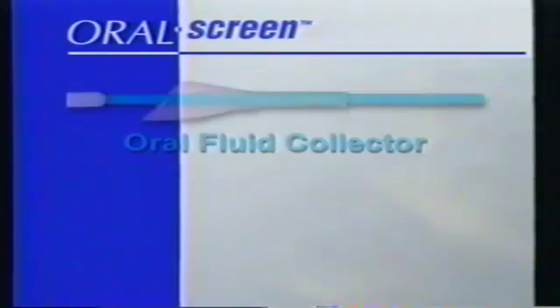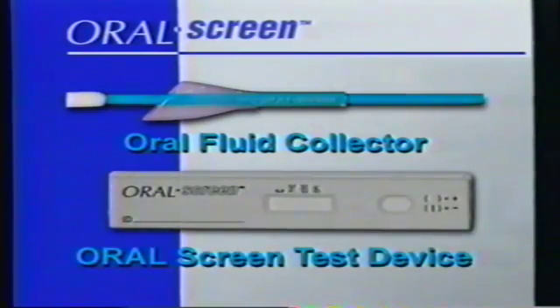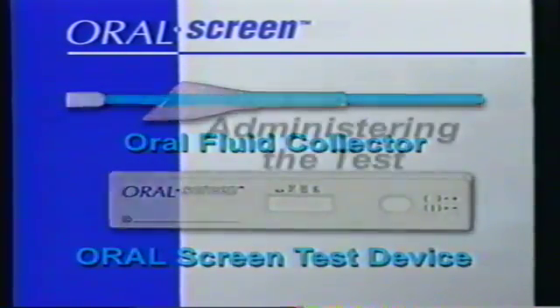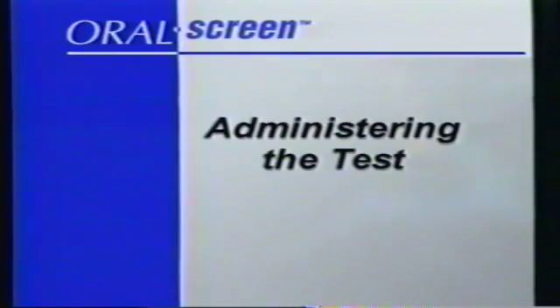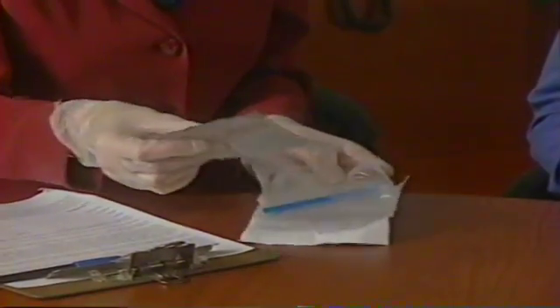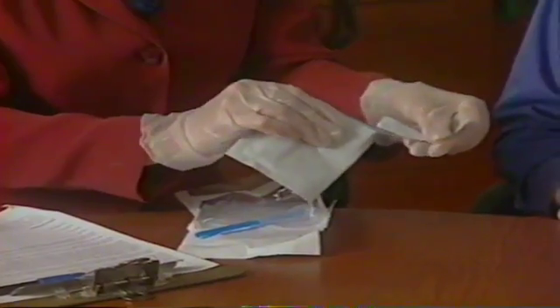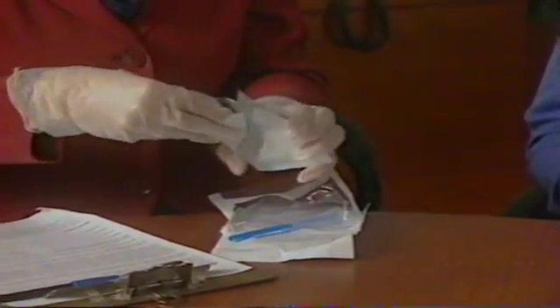The oral screen system consists of two components: the patented Oral Screen oral fluid collector and the Oral Screen test device. We'll now take you through the testing process step by step. Remember that Oral Screen is only valid for use with oral fluid. The Oral Screen system should be stored and used at room temperature. It's important that the test device remains sealed in the package until you're ready to use it.